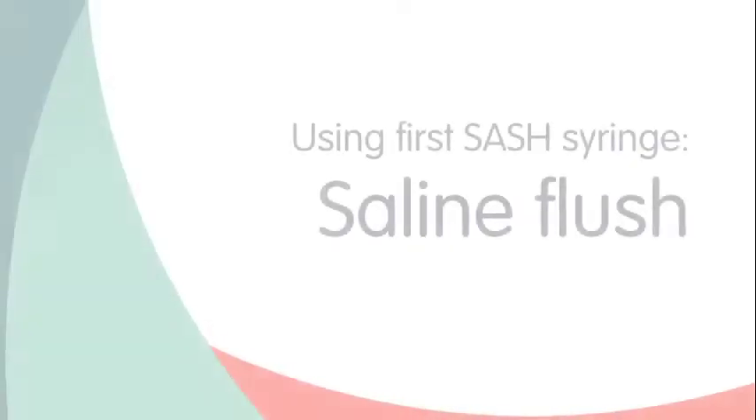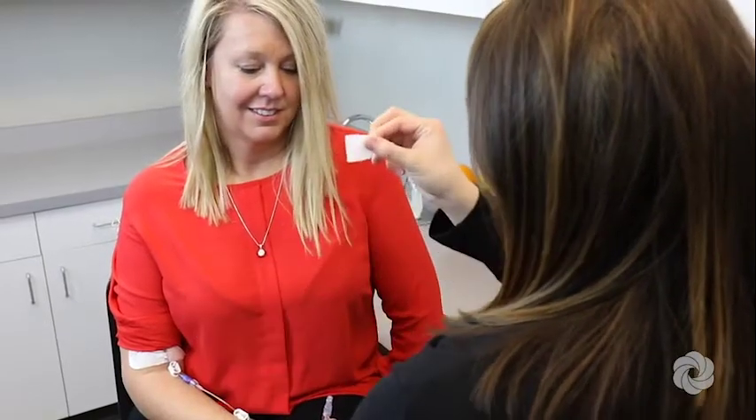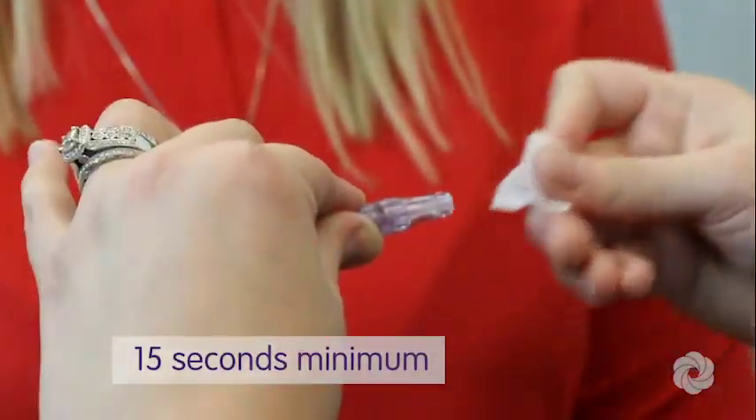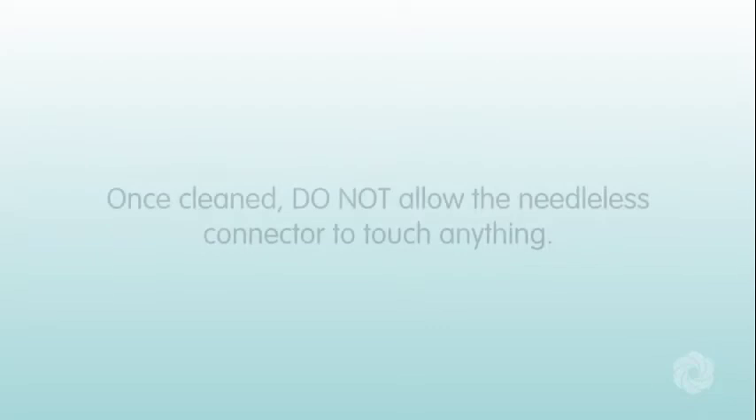You are now ready to flush your IV line with saline. Scrub the needleless connector on your IV catheter with an alcohol wipe for at least 15 seconds and allow to air dry. If your order indicates a different scrub product, please follow physician orders for your line. Once cleaned, do not allow the needleless connector to touch anything.